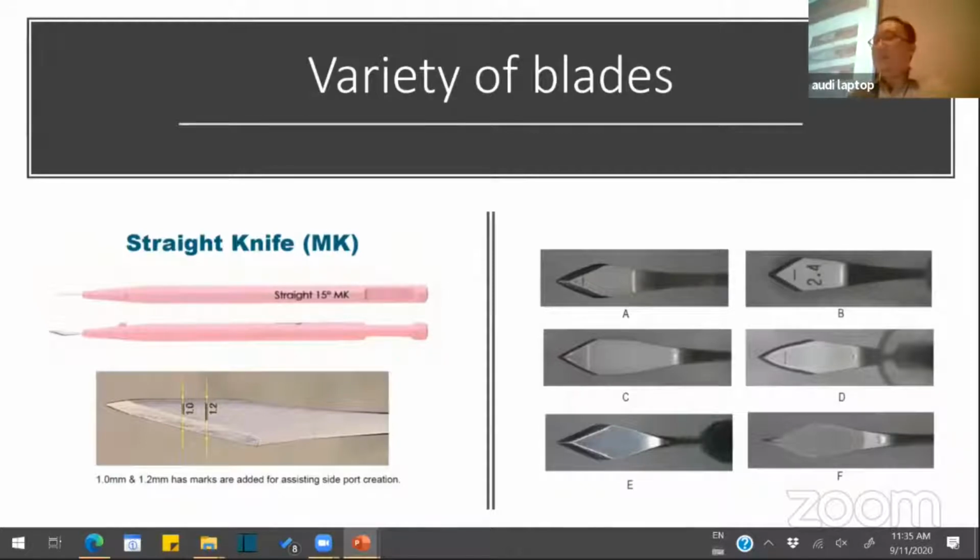I just understand that, you know, I can point, okay, you call this 15 degree because when you draw a line straight across there, this is actually 15 degree. There's also a 0 degree blade, but I rarely use this. That's why I only come to know about this today. All right. So thanks, Nazra.